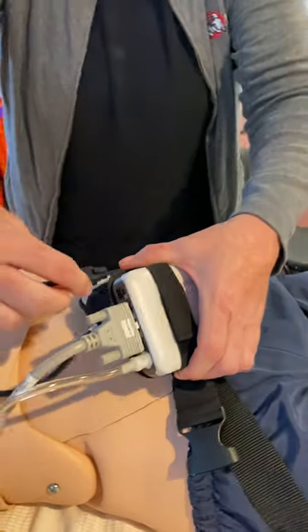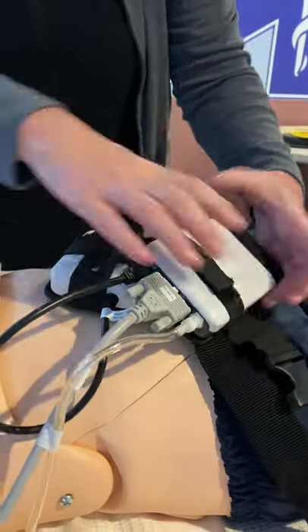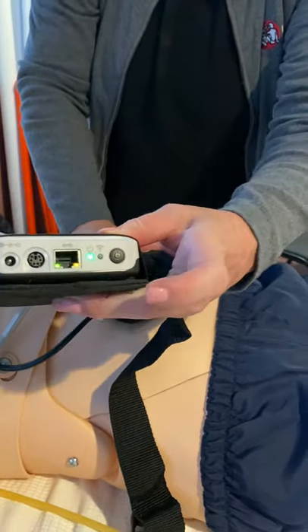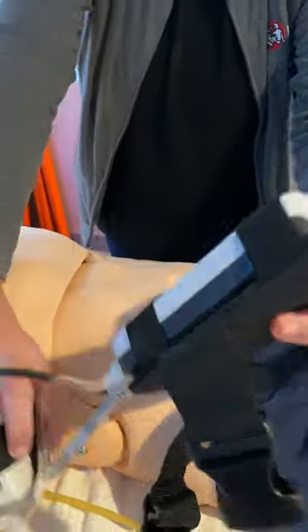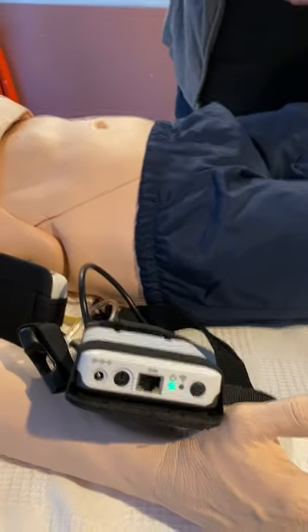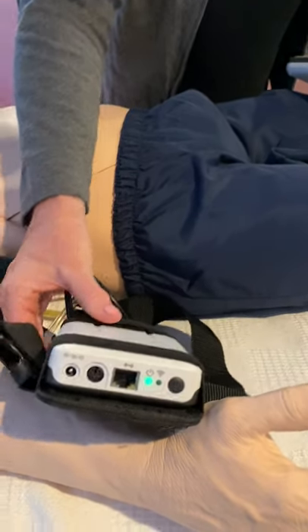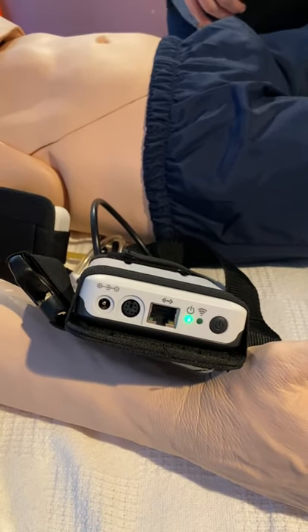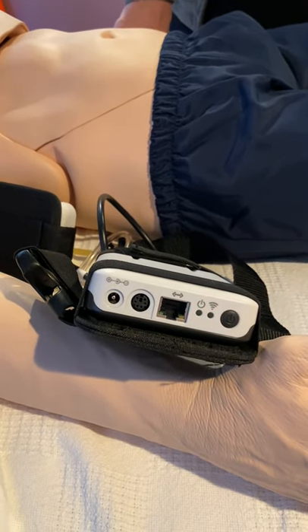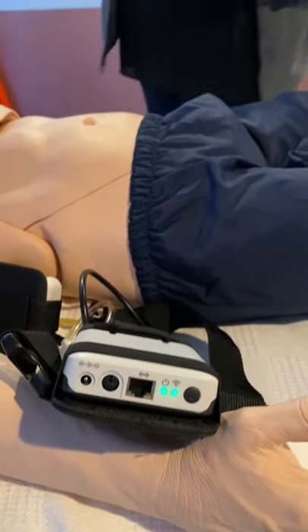The external battery connects right here, so you would just plug this in when you come in to interact with the mannequin. Once the battery is plugged in, you're going to hit the power button on the link box and it's going to become green. It'll blink for a little bit and then you'll see two green buttons. It does take a minute or so to turn on once you connect the battery. Great — we've got two green buttons.